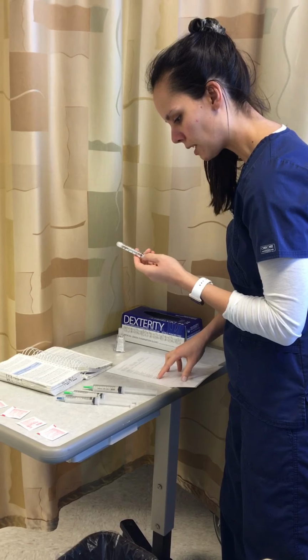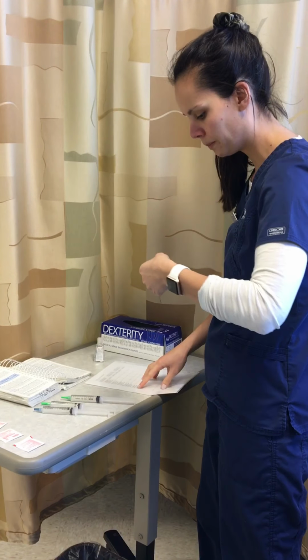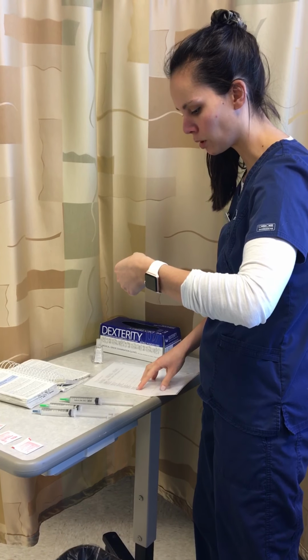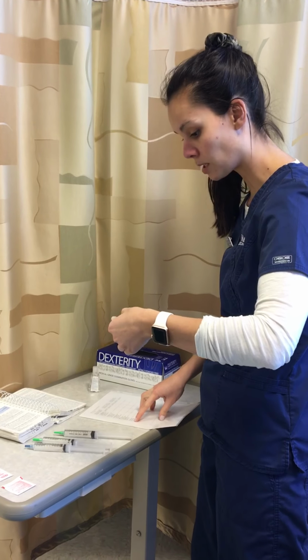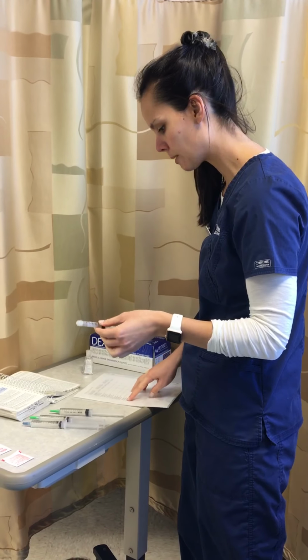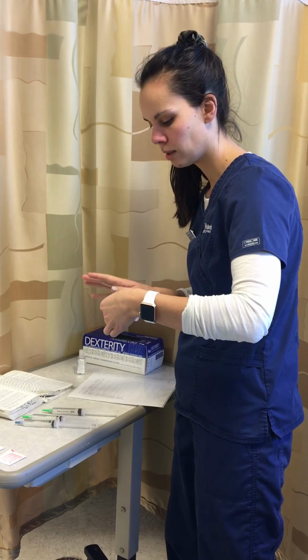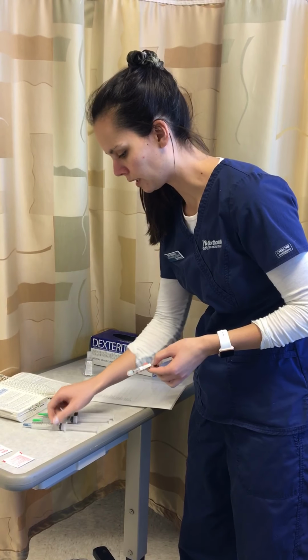So I did my math, and she has 4 milligrams of the Zofran due. The Zofran is 5 milligrams per 2 milliliters, so 4 milligrams is equal to 1.6 milliliters. I looked at my expiration date, and it's not expired. My flushes are not expired either.